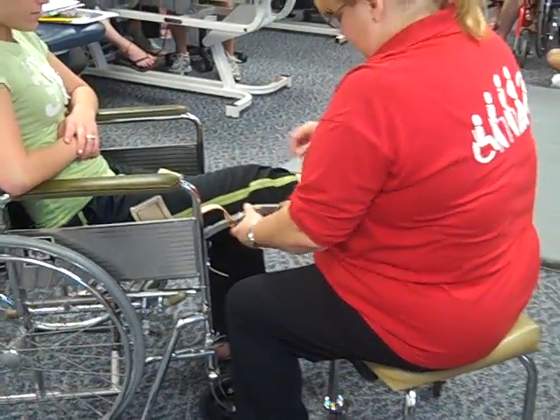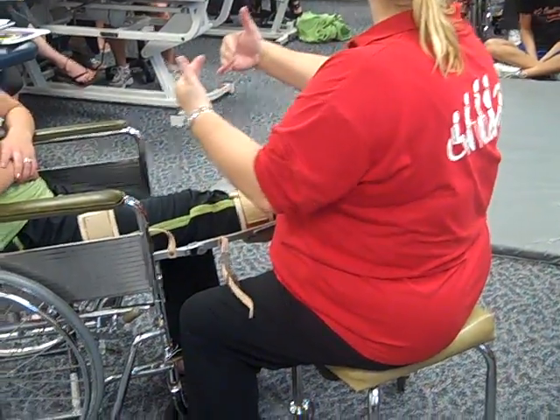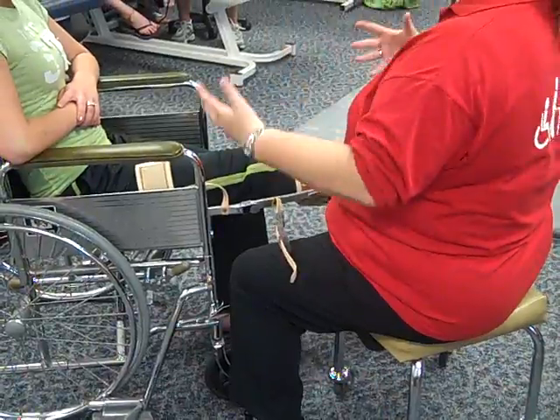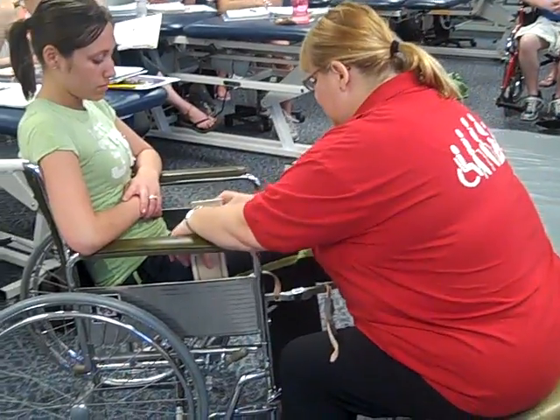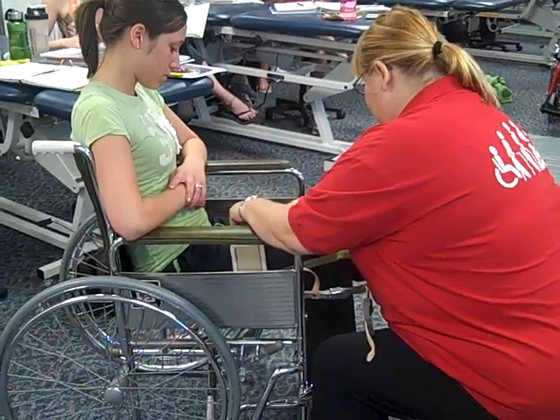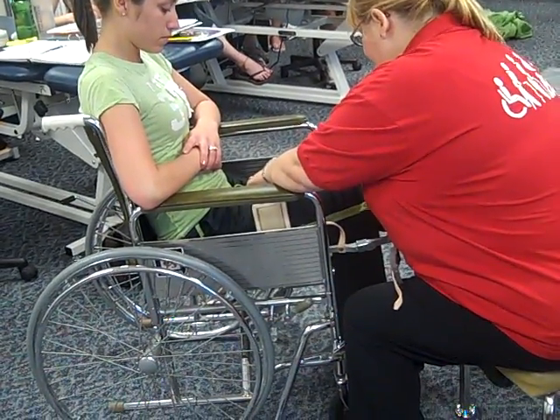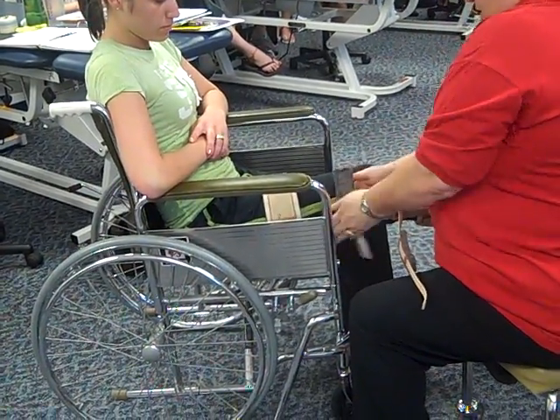At this point I want to see how high up into the groin it's going to go. I don't want to go very far up into the groin, but I do want it as far up on the thigh as I can put it comfortably for the patient — remembering that when the patient stands up, they're going to sink down into this a little bit more. So just make sure those are loose, and then that whole upright should lower just a little bit. Then I'm going to tighten it down. That side looks pretty good, so I'll go ahead and tighten it as is.